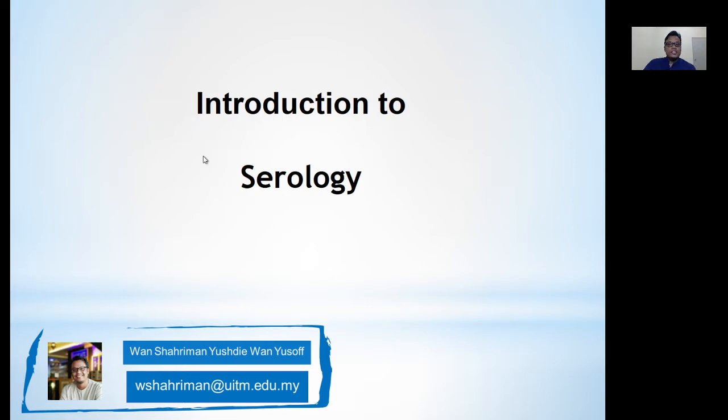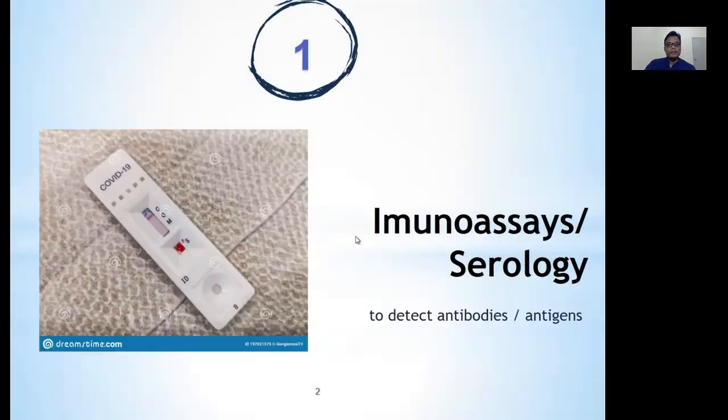So this lecture, I will talk about serology. First part, introduction to immunoassays or serology. Serology is the method or test that can be used to detect specific antibodies or specific antigens in a patient.